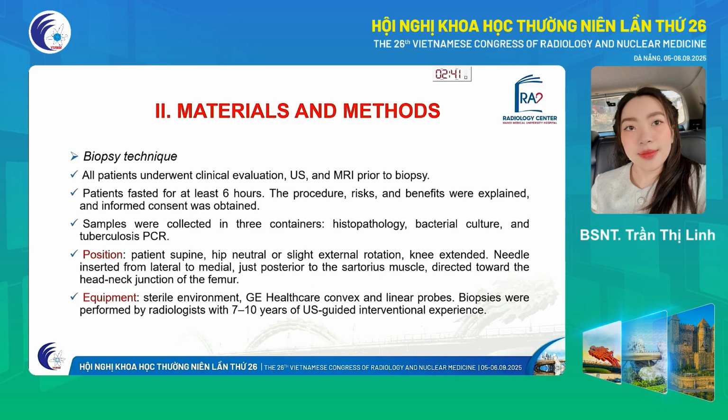About the biopsy technique, all patients underwent clinical evaluation, ultrasound, and MRI prior to biopsy. Patients fasted for at least 6 hours. The procedure, risks, and benefits were explained and informed consent was obtained. Samples were collected in 3 containers: histopathology, bacterial culture, and tuberculosis PCR.